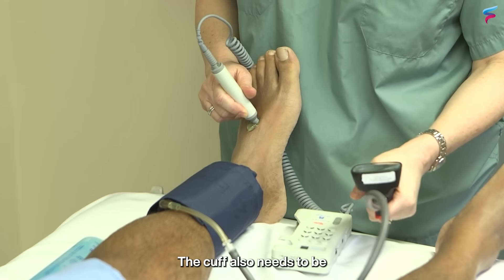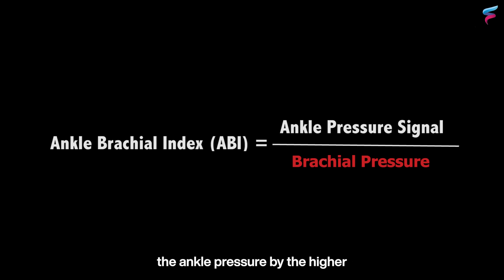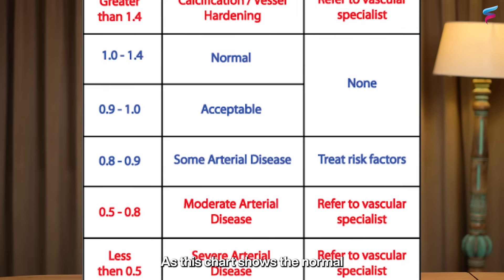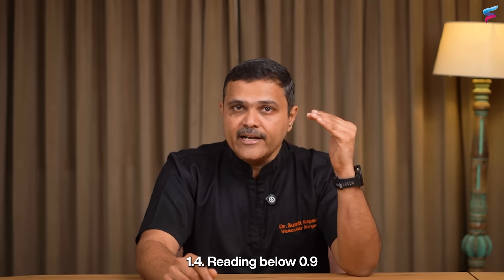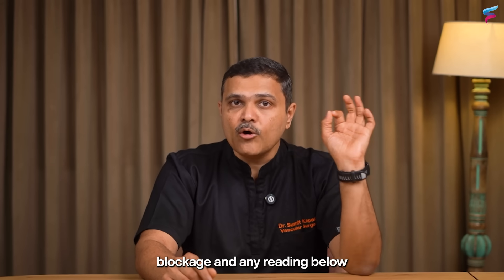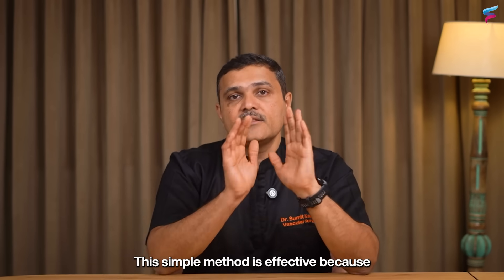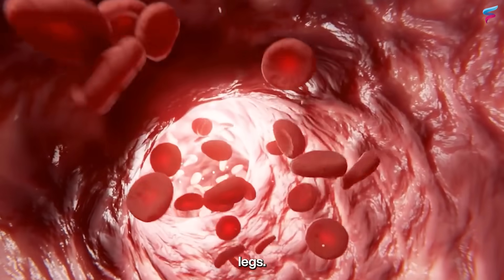The cuff also needs to be tight enough — not too tight and not loose. Once you have the numbers, divide the ankle pressure by the higher arm pressure to calculate the ABI for each leg. You can have an ABI for your left leg and an ABI for your right leg. As this chart shows, the normal ABI is usually between 1 and 1.4. A reading below 0.9 indicates some artery blockage, and any reading below 0.5 is considered severe and requires urgent medical attention. This method directly compares pressures and shows how well blood is reaching your legs, though it does not pinpoint where the blockage is.